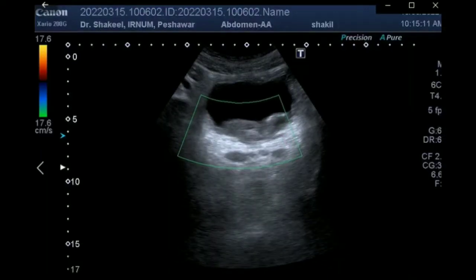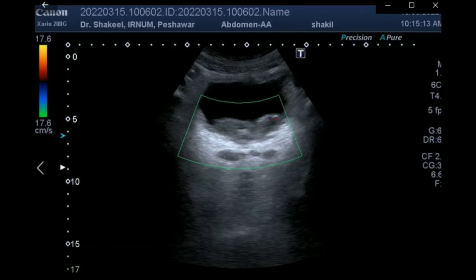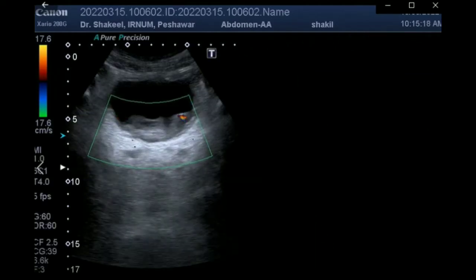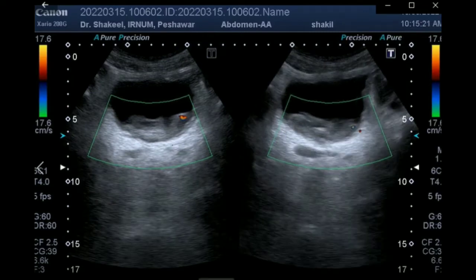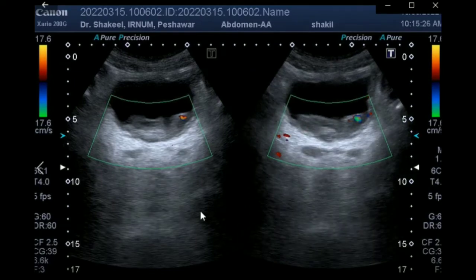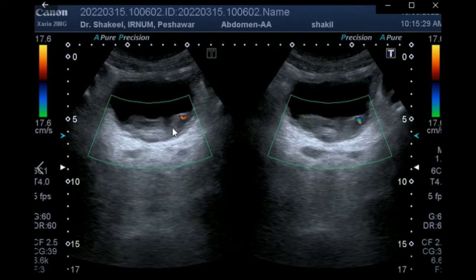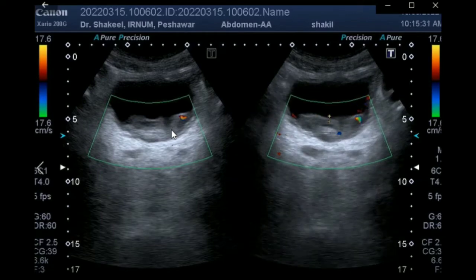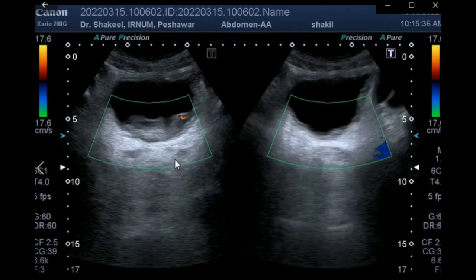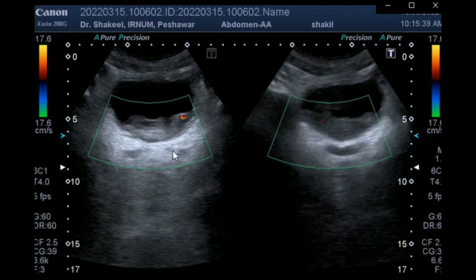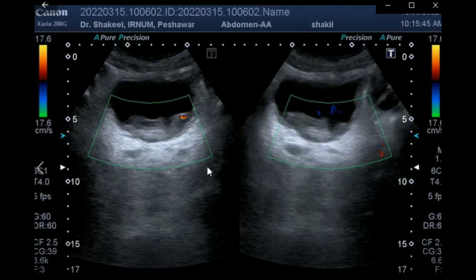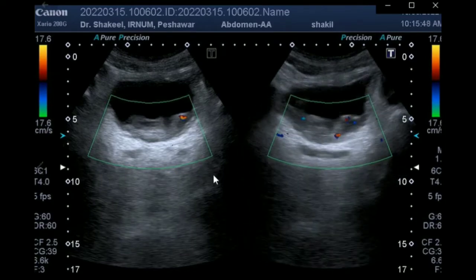This is a 50-year-old male patient who presented with gross hematuria. He underwent an abdominal scan, during which it was revealed that there is a heterogeneous solid mass attached to the posterior wall of the urinary bladder. On color Doppler, it was also revealed that flow is present in the growth.